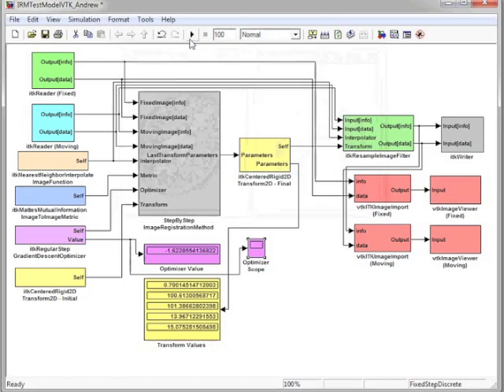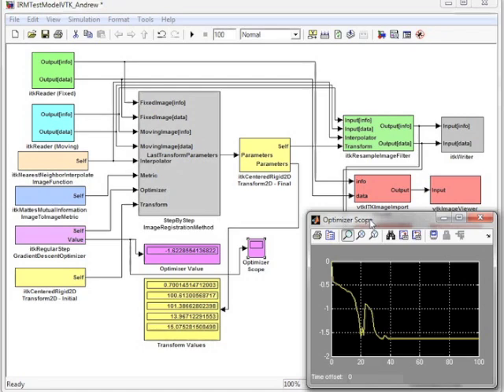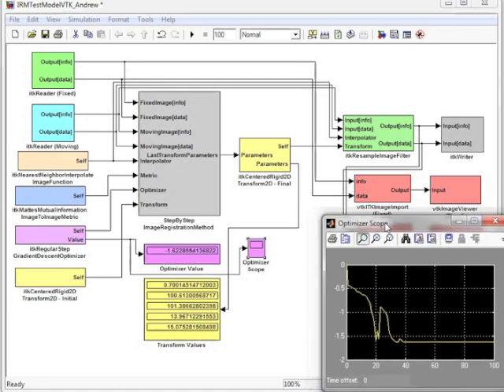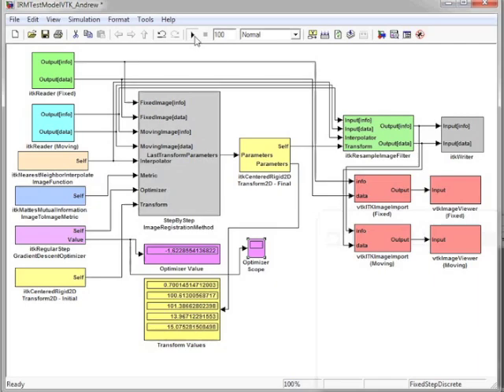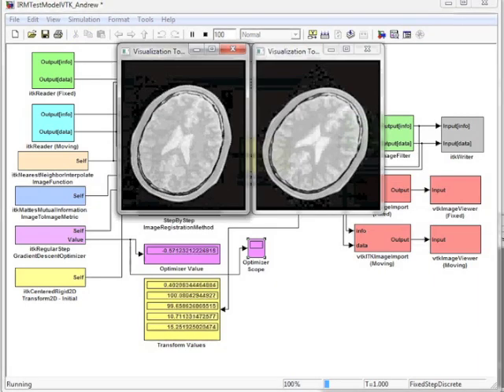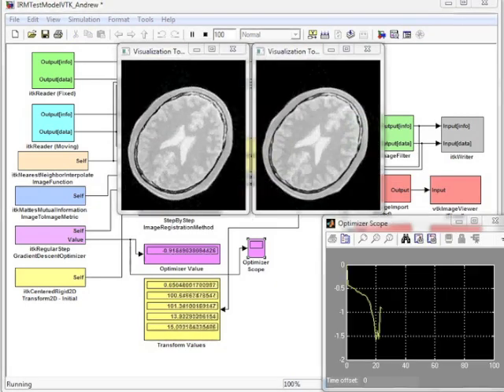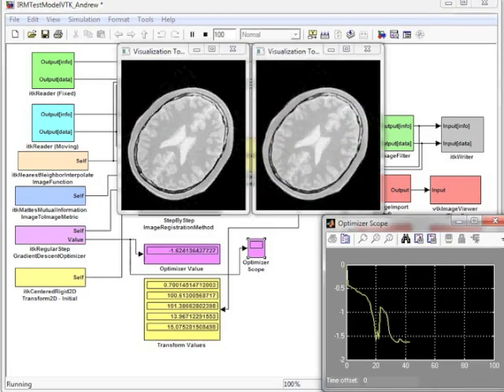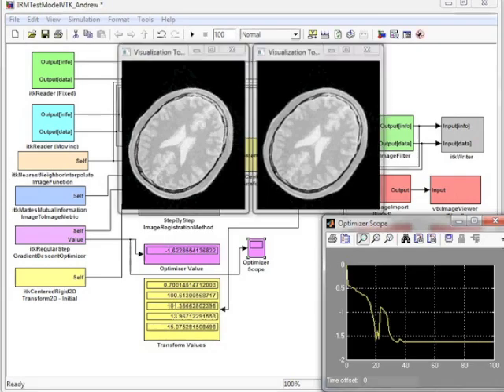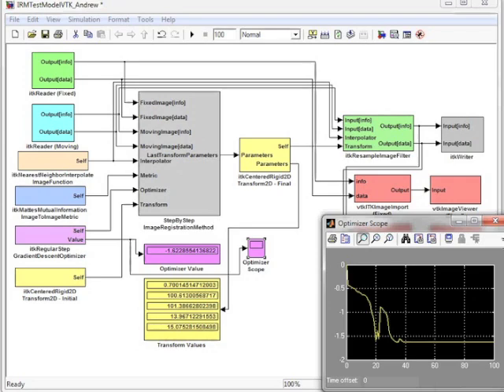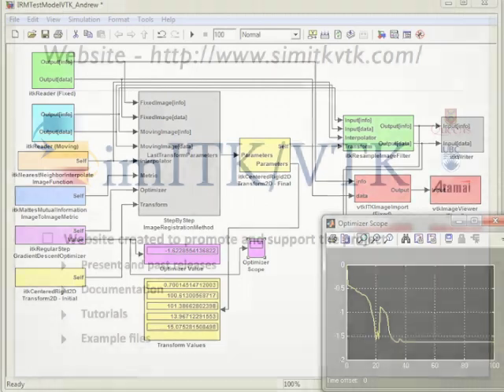But we can also attach a scope to the optimizer block, and watch the optimization and registration happen in real time. Let's rerun the registration. Here we can see initially that the two are out of alignment, and then somewhere around the 40-second pass-through, everything is lined up. This is a great example of SimITK interacting with current Simulink blocks.